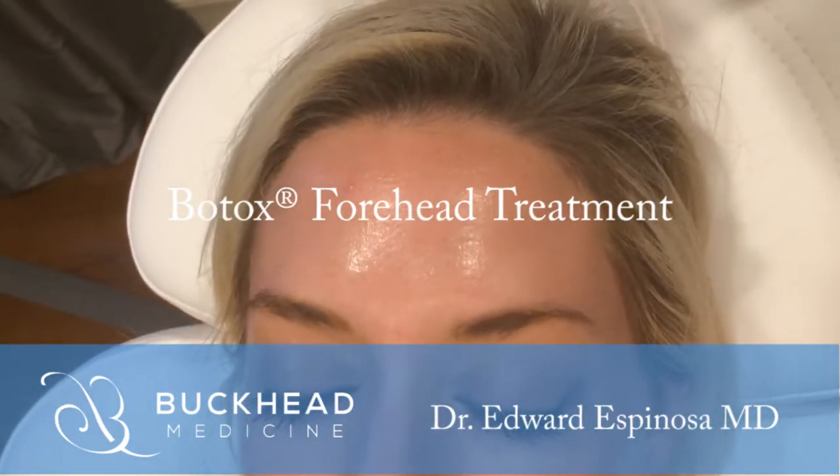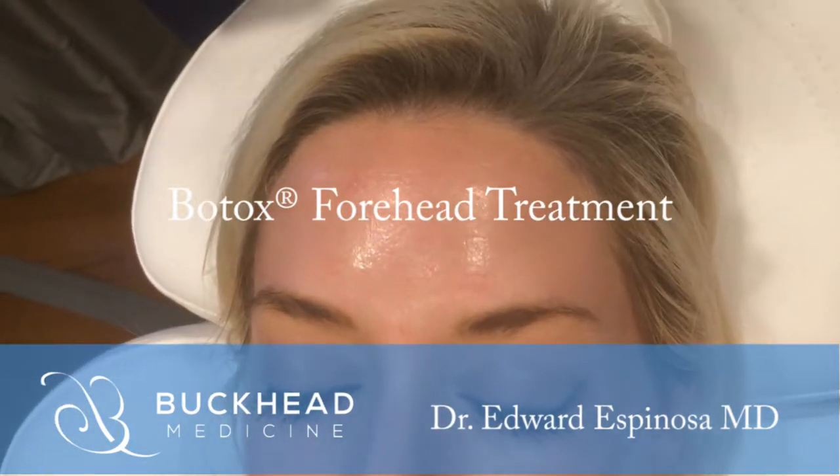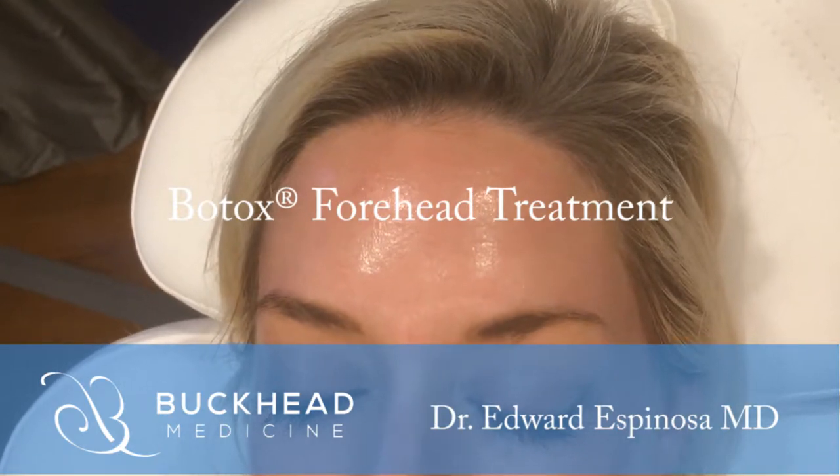We're treating the frontalis muscle, and really this area is almost what we describe as the PPD or the TB technique of injection. They're just very superficial injections.